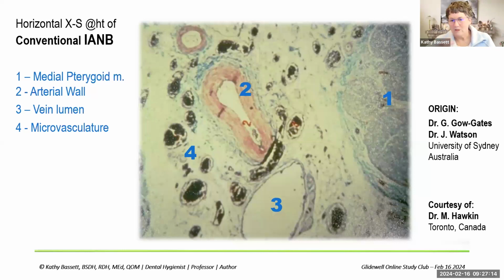They're not rigid, and easy to move into. And remember, arteries have their own contractile tissues, and they're not just waiting for us to stab into them. They're going to be able to kind of deflect away. So mostly what we're aspirating is happening around those structures.